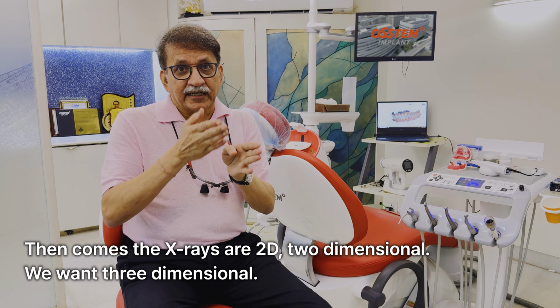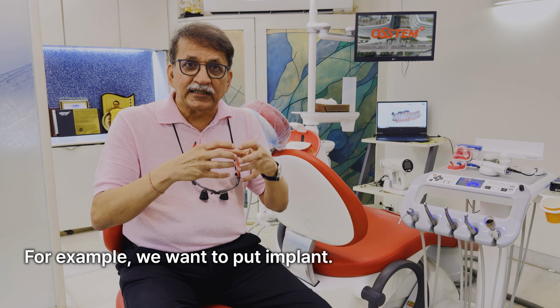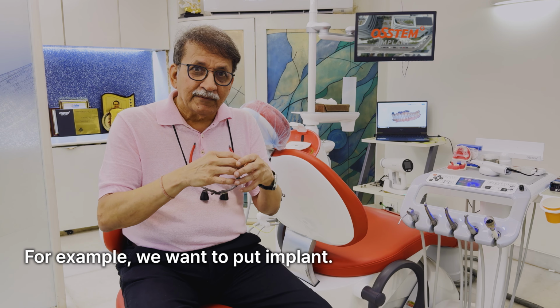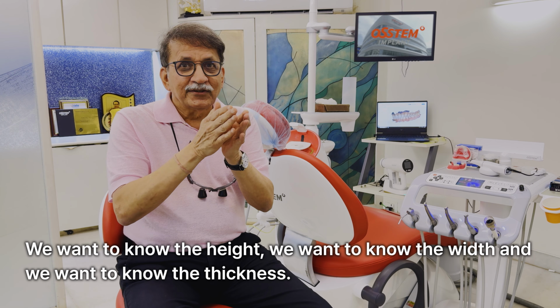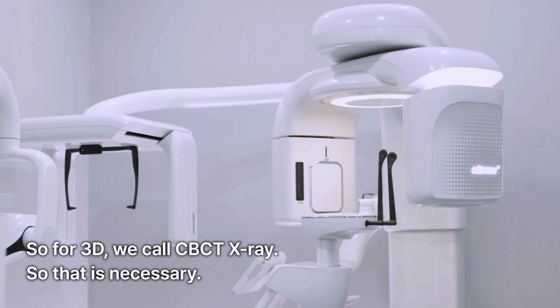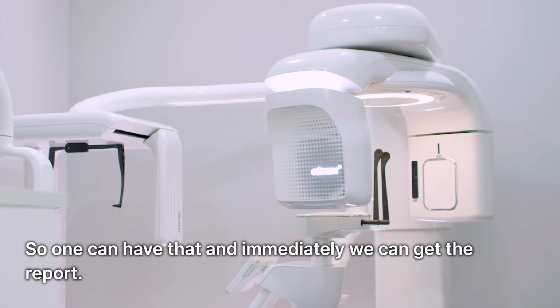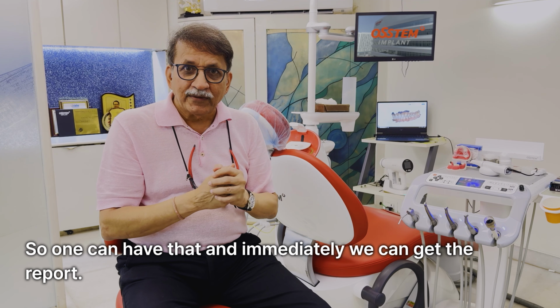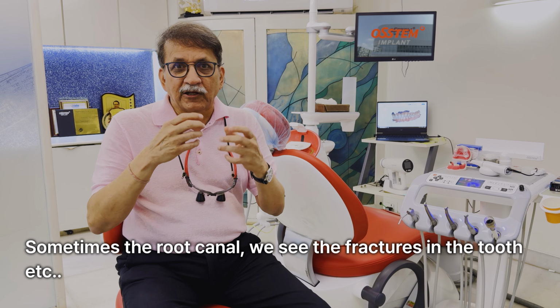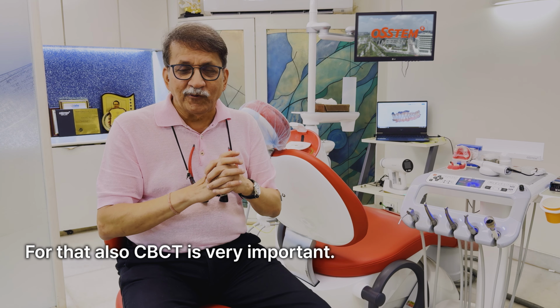Then comes the fact that X-rays are 2D, two-dimensional. We want three-dimensional. For example, you want to put implants. We want to know the height, we want to know the width, and we want to know the thickness. So for 3D, we call it CBCT X-rays. So that is necessary. One can have that, and immediately we can get the report. Sometimes in a root canal, we see fractures in the tooth, etc. For that also CBCT is very, very important.